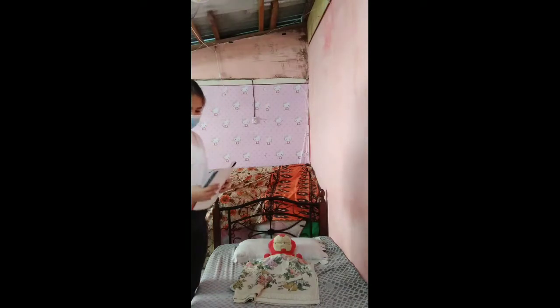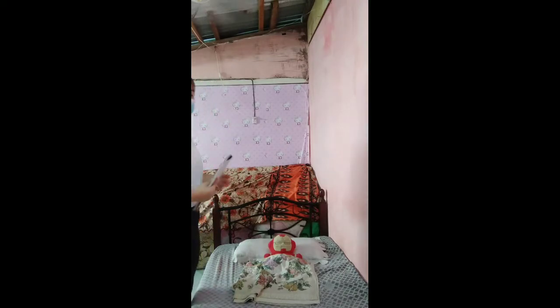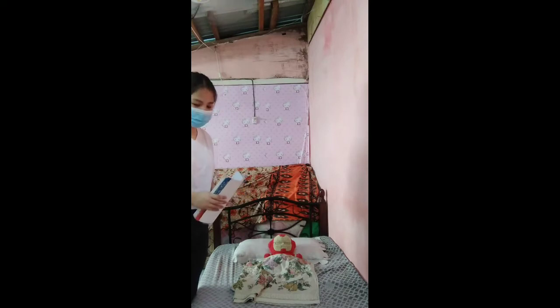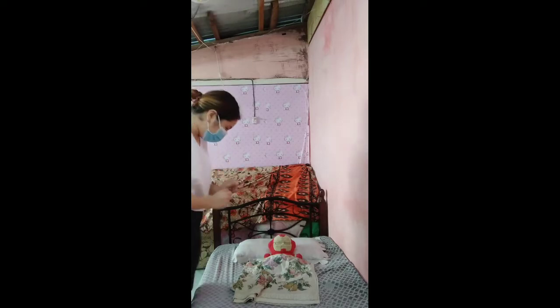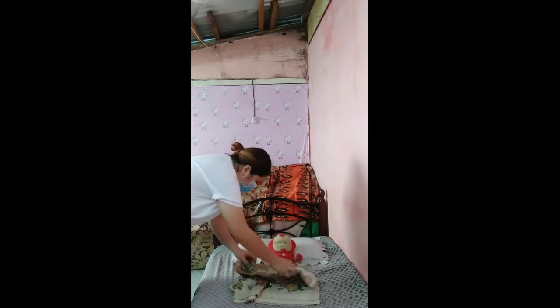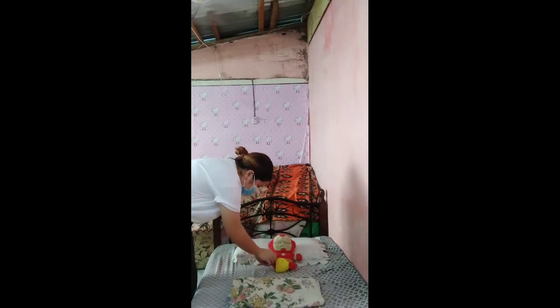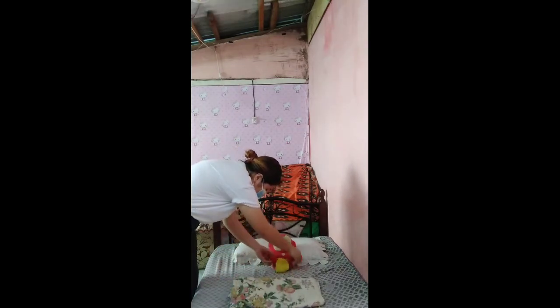So the next step is to ensure the privacy of the patient. So we need to close all the curtains. So I have closed all the curtains. So the next step after ensuring the privacy of the patient, we need to position the patient in lithotomy position. So ma'am, are you ready? So, we want you to position into lithotomy position. So, your knees are flexed here.